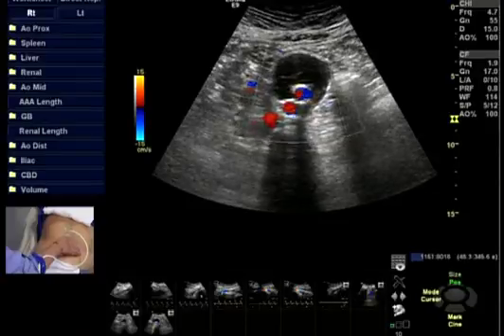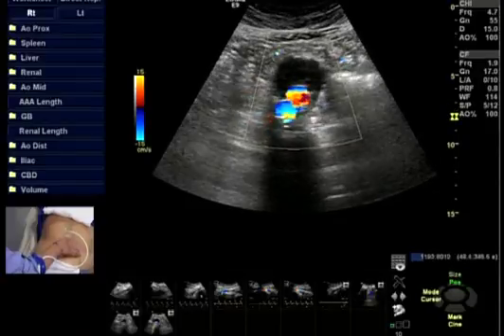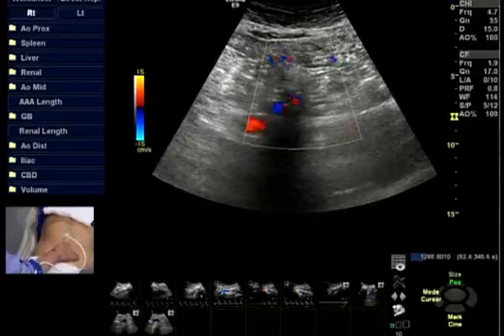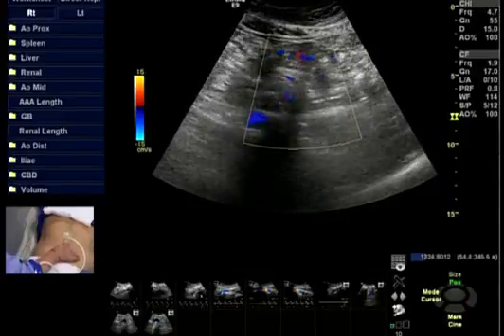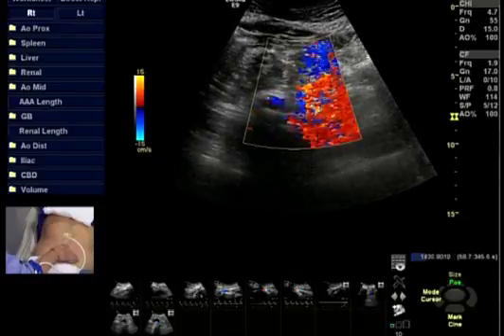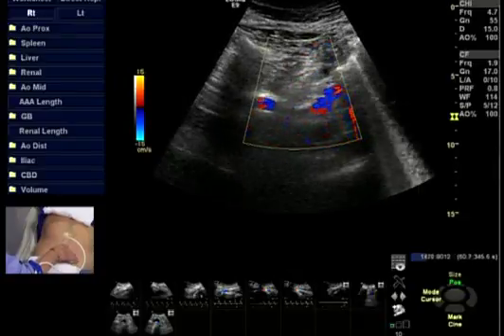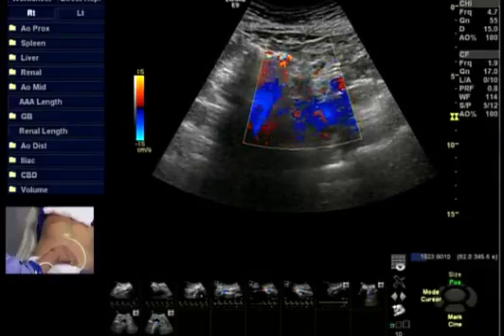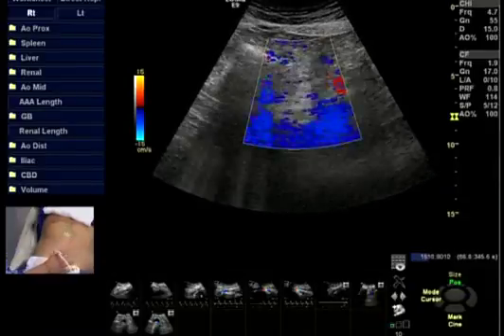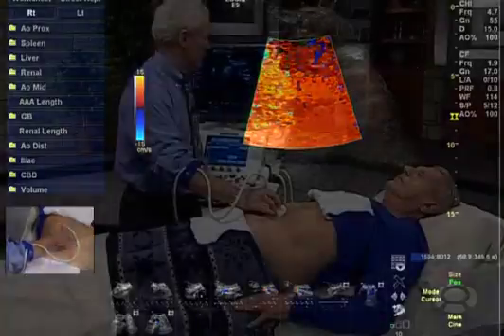Continuing again, remember this is just a brief survey. Down through, anatomically see where things are. Get to the aortic bifurcation. See the iliac vessels split off and splay quite wide to either side of the color region of interest. And then in this particular view, lose them to further sight.